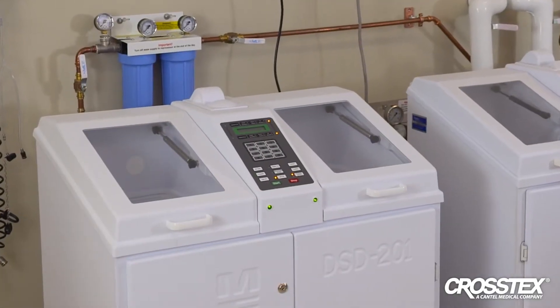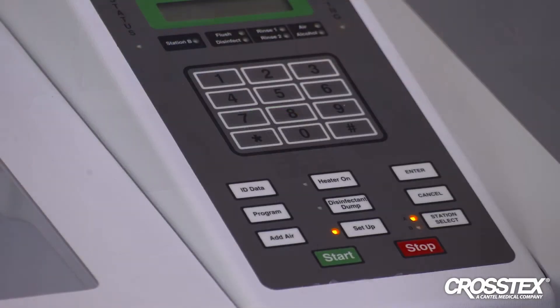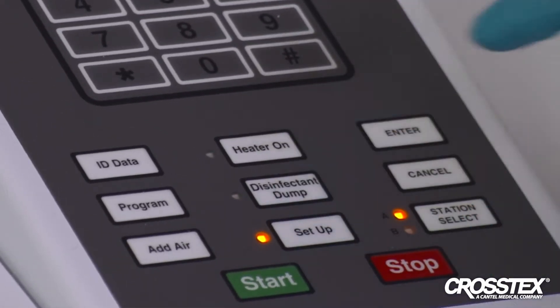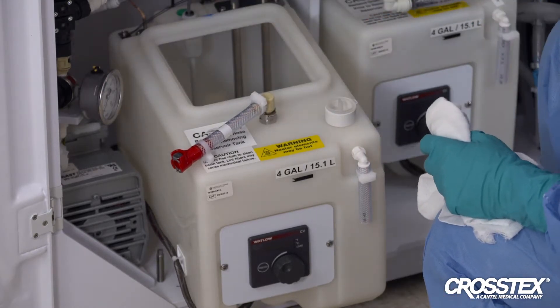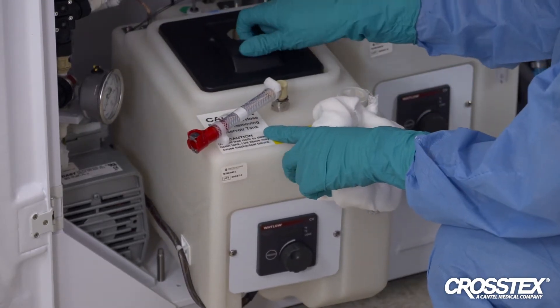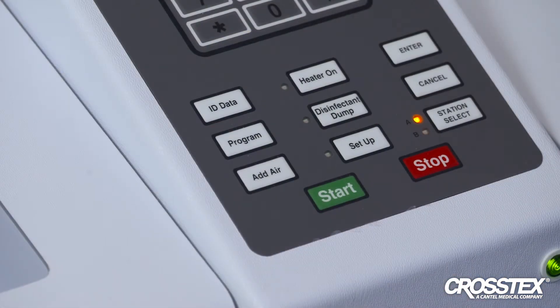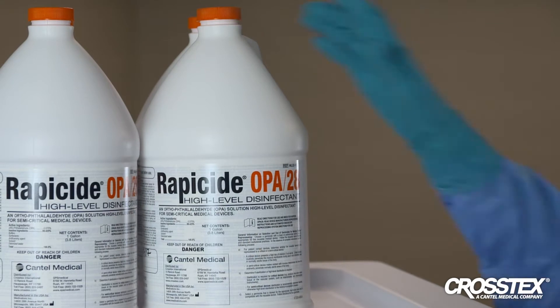To clean out when switching from one type of disinfectant to another in the Medivators DSD reprocessor, follow these steps. Remove the existing disinfectant by evacuating it from the reservoir tank — this can be done by pressing the disinfectant dump and start keys on the AER control panel. Visually ensure that the reservoir tank is empty, then remove the tank and wipe it clean with a damp lint-free cloth. Refit the tank in the machine, fill the reservoir tank with fresh water, and run two standard cycles with the fresh water, then dump again using the same control panel process. The Rappaside HLD solution is now ready to be added.